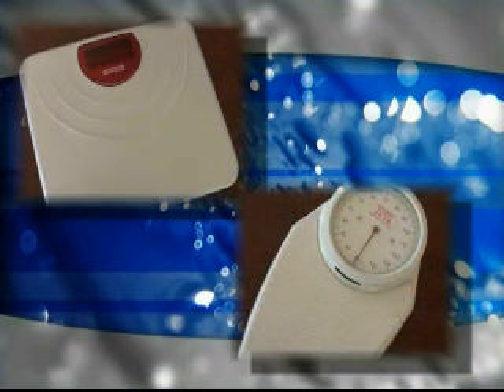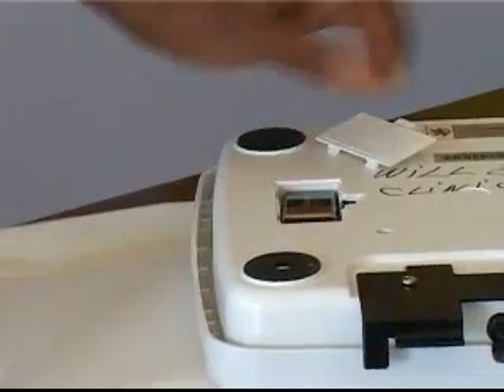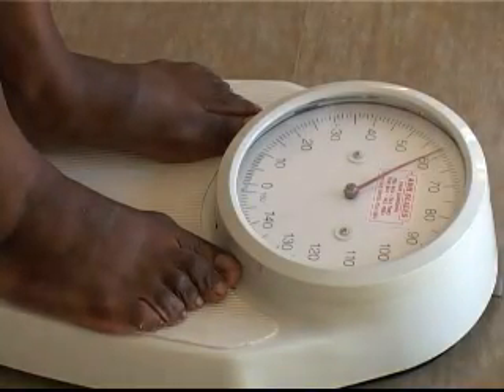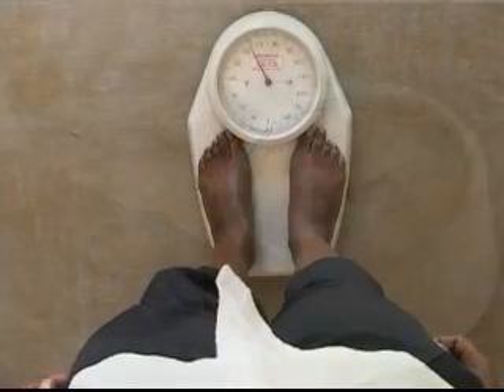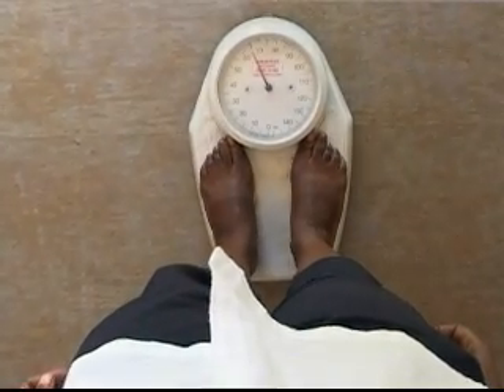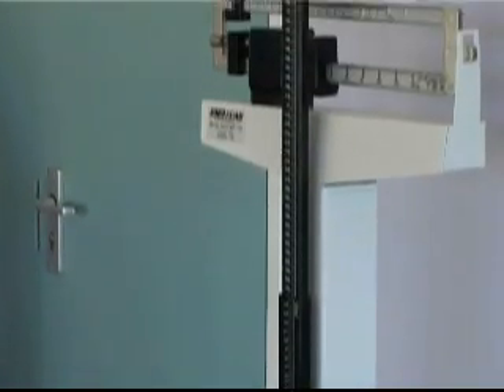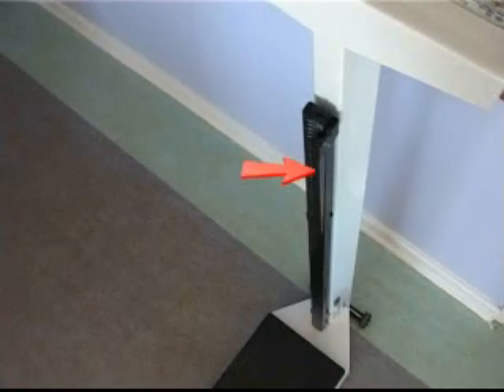Bathroom weighing scales, with a range of 0 to 150 kg, are either mechanical or electronic. The electronic type is fitted with a battery. The bathroom type weighing scale is cheaper than beam scales, but the mechanical type is not accurate enough for babies and children. The physician scale uses a sliding beam and has a range of 0 to 150 kg and is usually equipped with a height-measuring rod.